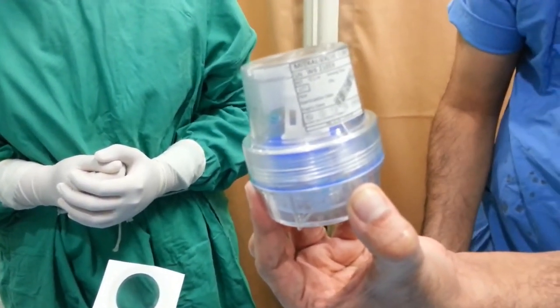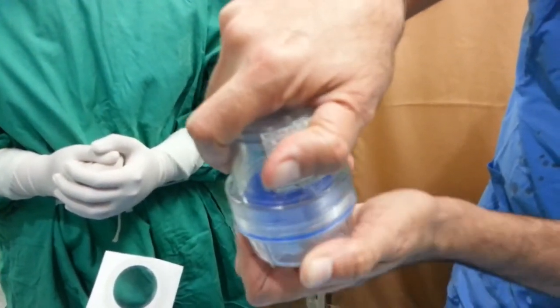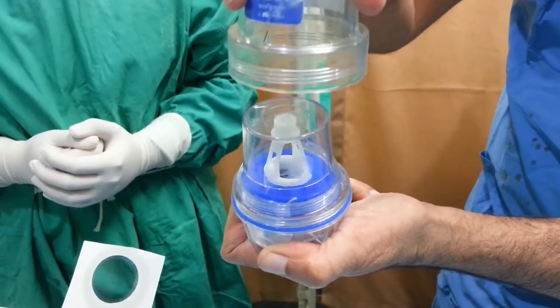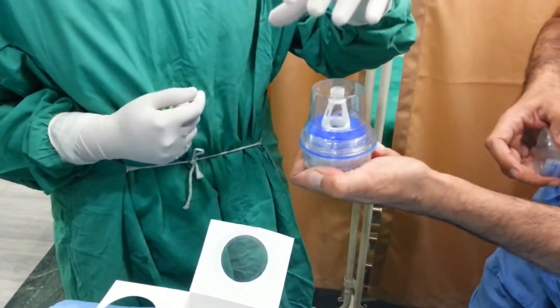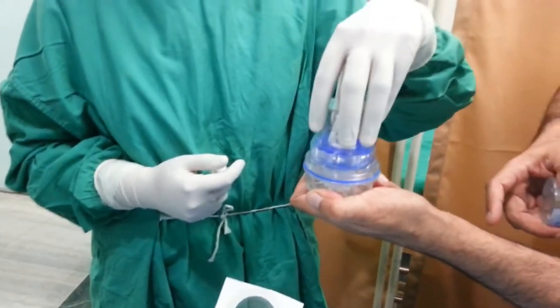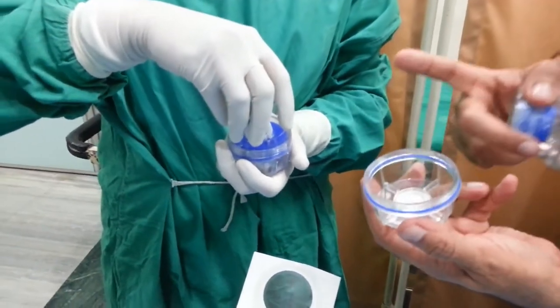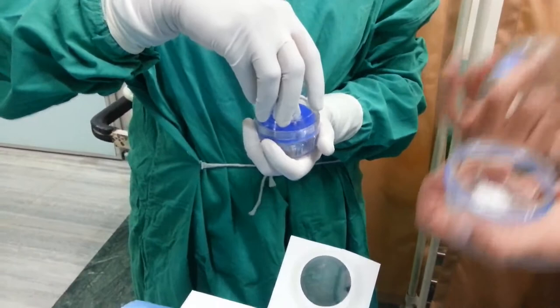That's important. Then this right hand, which is free, you open the top. It's designed for this. When you open the top, the valve is sitting inside. But it's in an outside container, unsterile. The inner one is sterile. Now this inner one is presented to the nurse, who takes it in the right hand and holds the bottom with the left hand. You understood? It is important that she takes it in her right hand and holds it in her left hand.